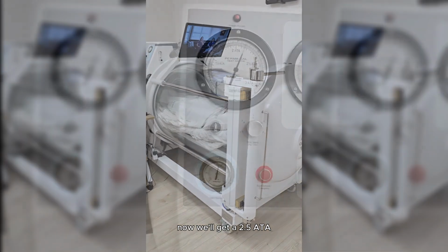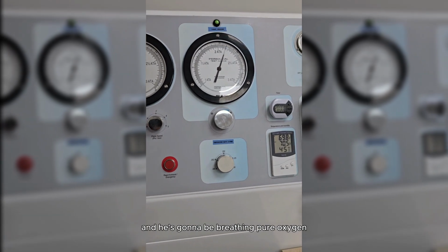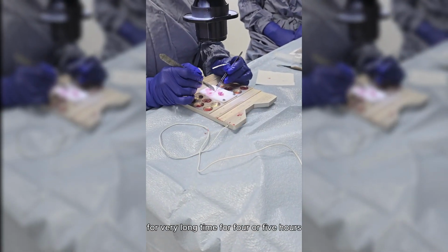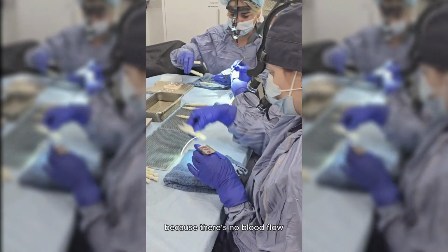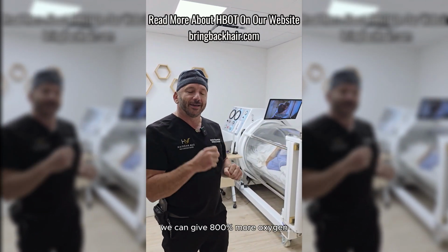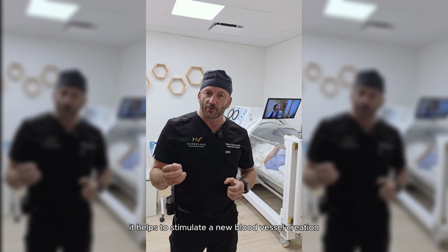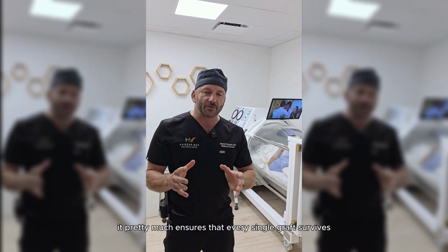Now we'll get to 2.5 ATA, which is the equivalent of 60 feet underwater, and he's going to be breathing pure oxygen. What it does is help to rescue these grafts, because the grafts were sitting outside the body for a very long time, for 4 or 5 hours, and they're pretty much struggling because there's no blood flow, so oxygen was not delivered. So now we can give 800% more oxygen delivered to every single graft. It also helps to reduce the inflammation. It helps to stimulate new blood vessel creation into the graft tissue. It pretty much ensures that every single graft survives after the transplant.